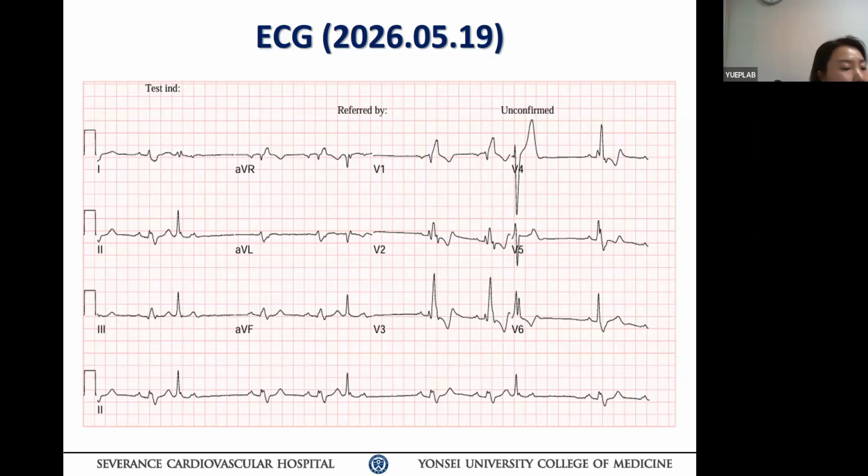Yeah. So it could be coming from the right bundle. Right. So when you have a right bundle branch block or left bundle branch block, the PVC ectopic activating the ventricle from the same blocked area normalizes the pattern. Think that way. Okay? Make sense? So now, can I explain this now?